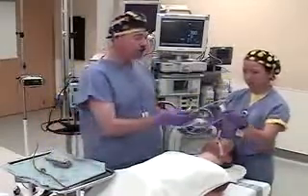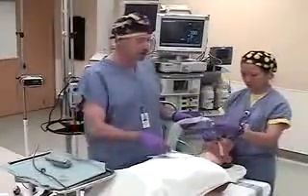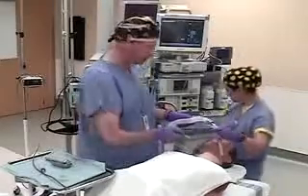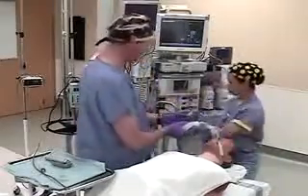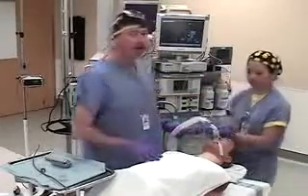If desired, a nasogastric tube could then be inserted through the gastric port of the Proseal. We're done.